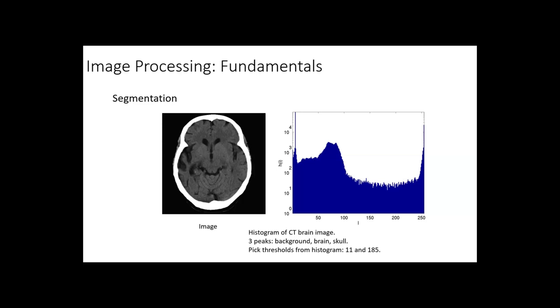Okay, so basically it's simple. The naive way is that we try to play with some magic number, a magic threshold. Maybe if the intensity is over 240, it belongs to the skull, and if the intensity is less than, let's say, 15, it is a background pixel, right? We just set the threshold, and we can separate the brain. So here I use an intensity threshold of 11 for separating the background, and the intensity threshold to take the skull out is 185.